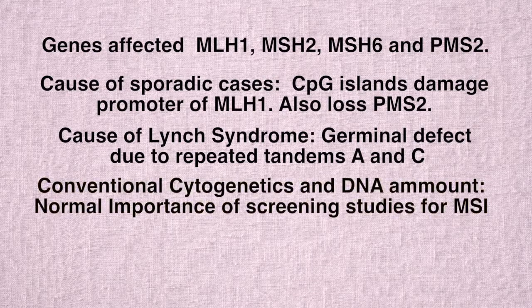Conventional cytogenetic studies and DNA amount in Lynch syndrome are completely normal, in cases of Lynch or sporadic MSI. Defects are not detected by conventional cytogenetics or determination of ploidy.